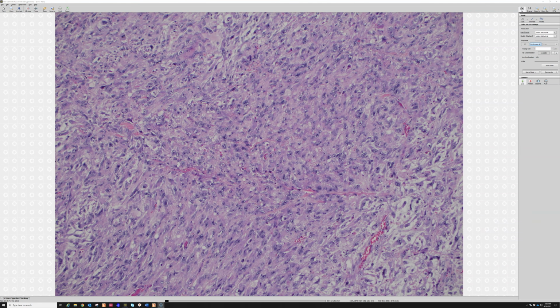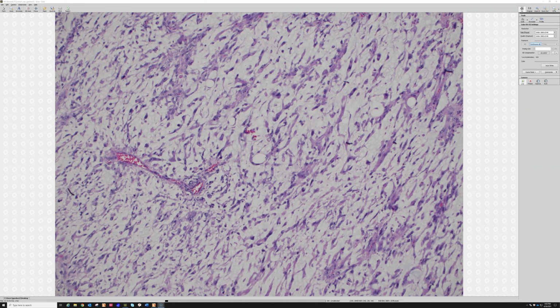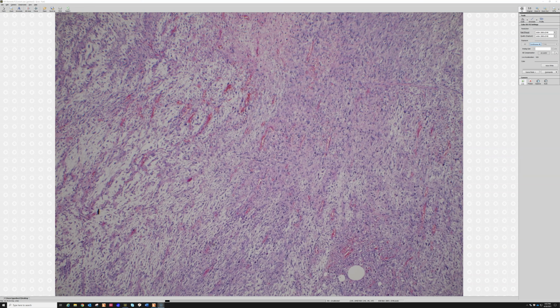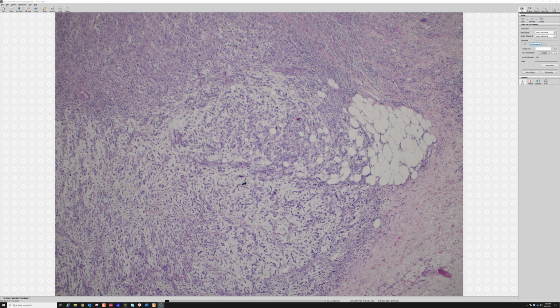So this is myxofibrosarcoma, and based on the presence of these sheet-like areas that basically look identical to what you'd see in an undifferentiated pleomorphic sarcoma, UPS, when you have sheet-like areas that look like that, and then other areas that are more loose and hypocellular and myxoid, then I'll call that myxofibrosarcoma high grade or grade 3, okay? And then the low-grade ones should just be scattered atypia in a myxoid background without much significant cellularity, and in between you can call it grade 2, although I find that most of the time I do that when it's a partial sample or a biopsy. I'll say myxofibrosarcoma, at least grade 2 on this sample, and I feel that a lot of times once those come out, they often end up turning out to be grade 3 in some area.